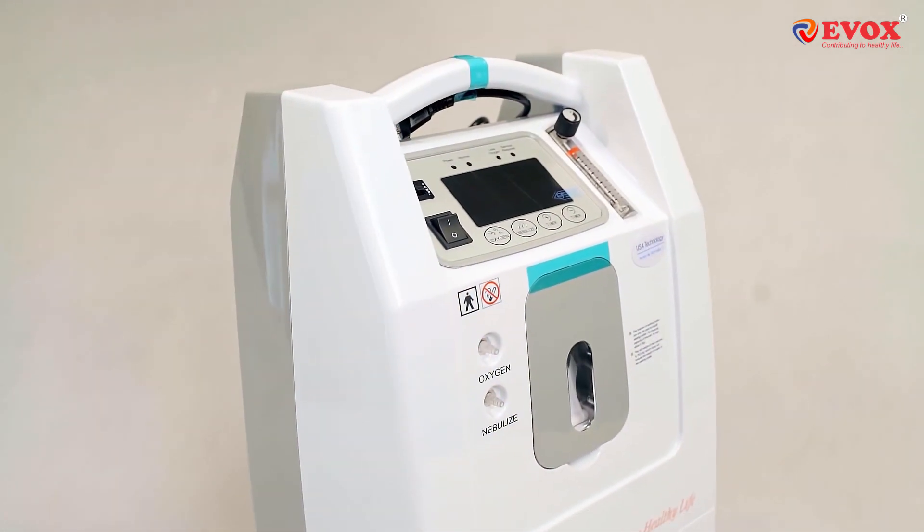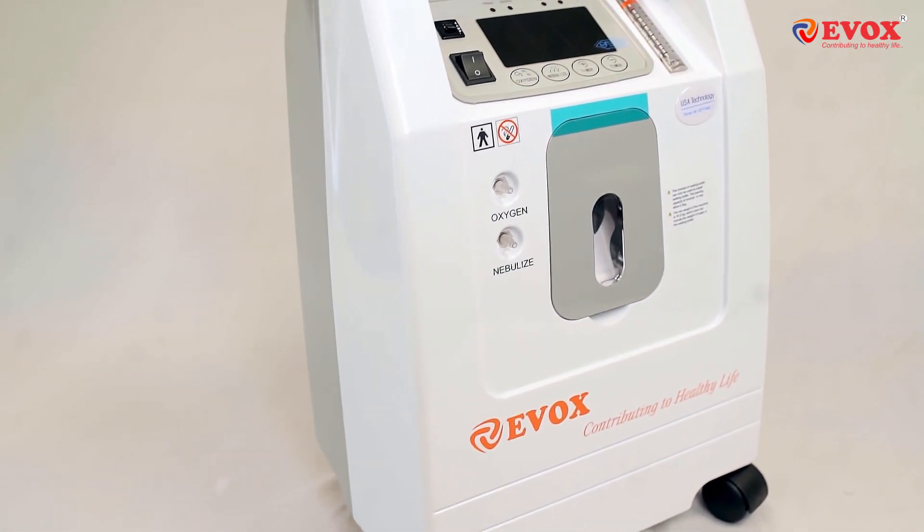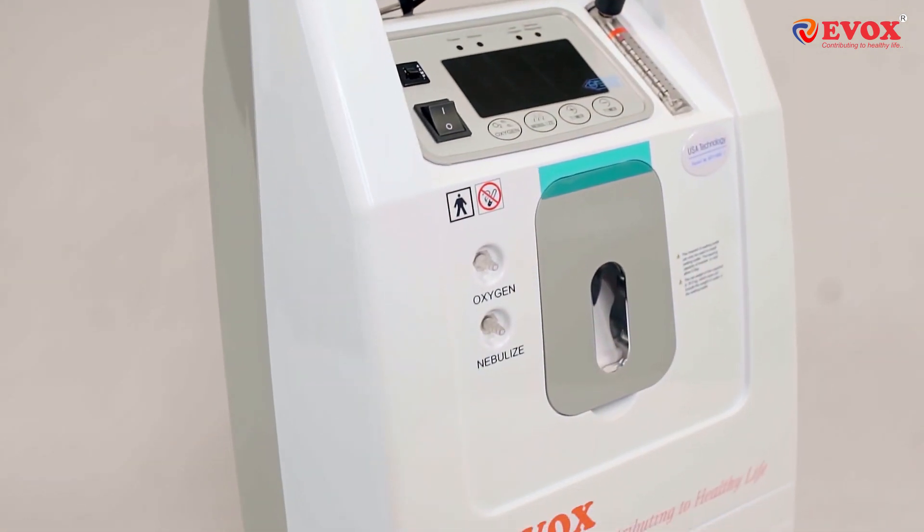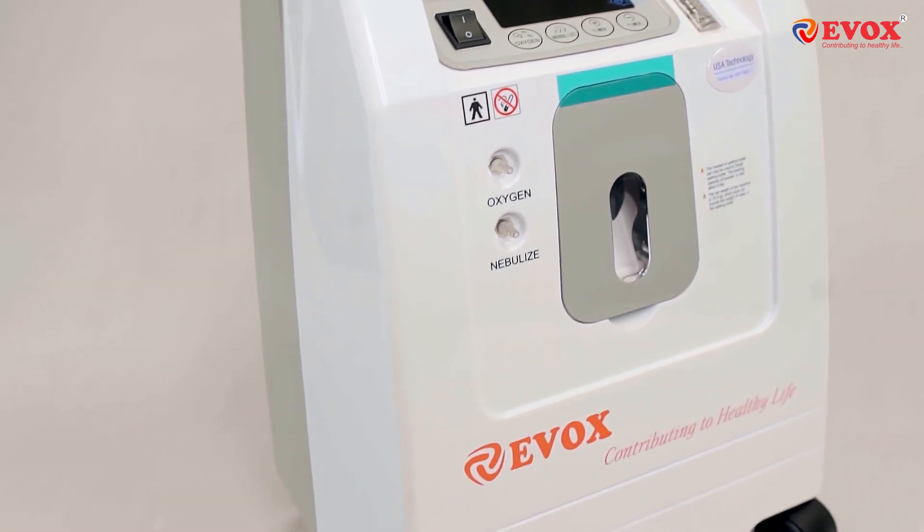We present to you the Evox Oxygen Concentrator. Here's a quick guide on how to use the Evox Oxygen Concentrator and its features. Always place the Oxygen Concentrator in an open area with at least one foot of free space around it.